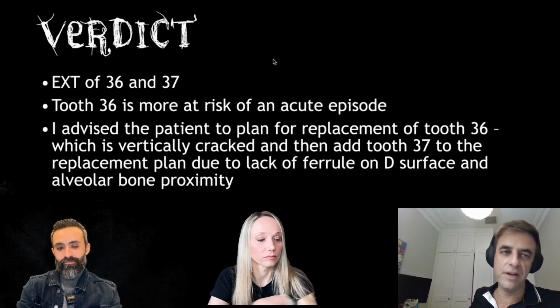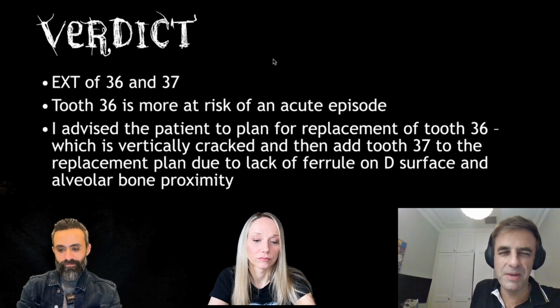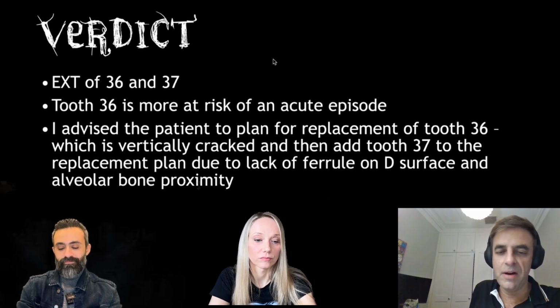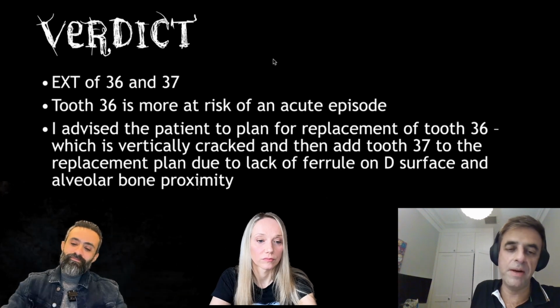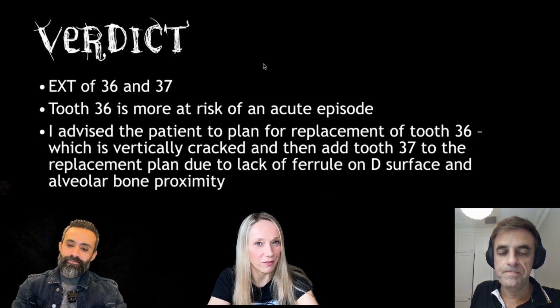And now the patient knows why the first molar tooth is a problem. They had slight tenderness and said it had been bothering them occasionally, and that's completely why, because it's fractured. You don't have to open up the tooth or check for the fracture either now. Thank you, Omar, because it's very informative and very helpful for the everyday clinical activity.